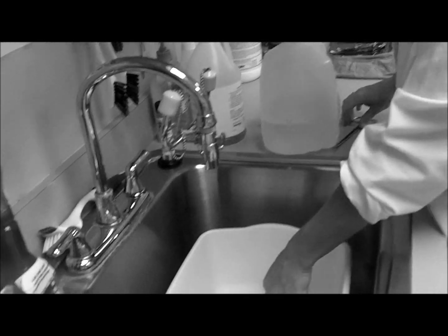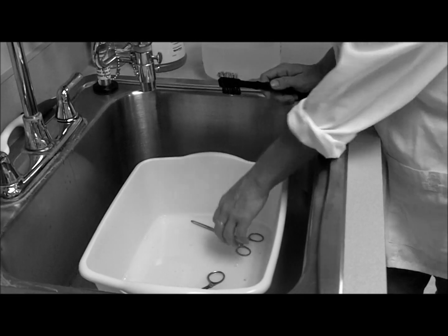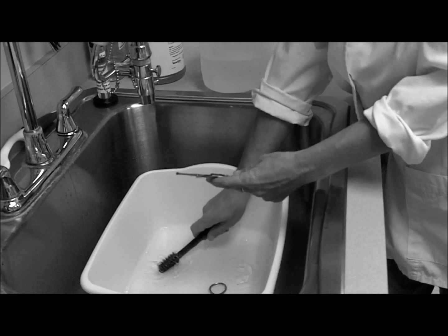Then you take your instruments and let them sit in there. Just a quick soak? No, you have to wash them very well, making sure to get into all the nooks and crannies.